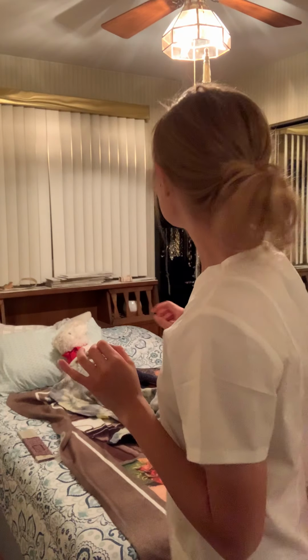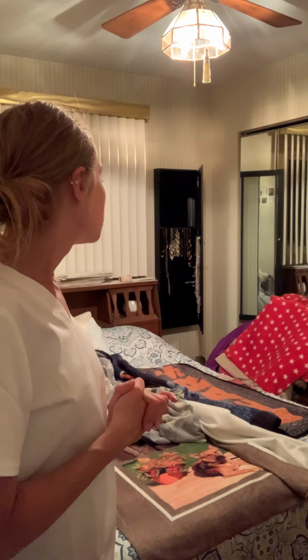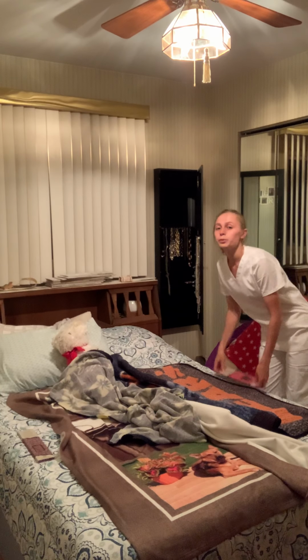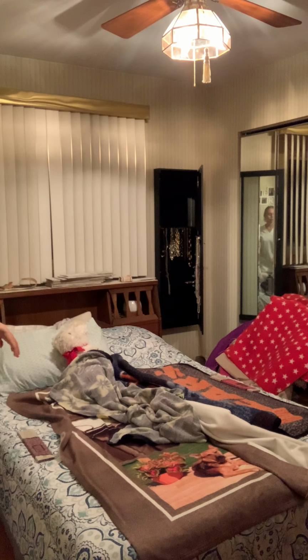So now that we set up the bottom linen, I forgot, when I was working on this side, I was supposed to take the railing off. So now I will be putting the railing back up on that side, because now I will be moving the patient on that side. Also, you will be explaining to the patient that they are going to be rolling over a bump, just to reassure them that they're not falling or anything like that.